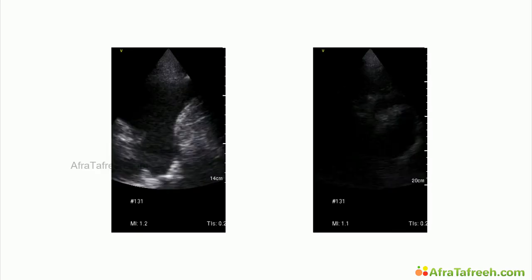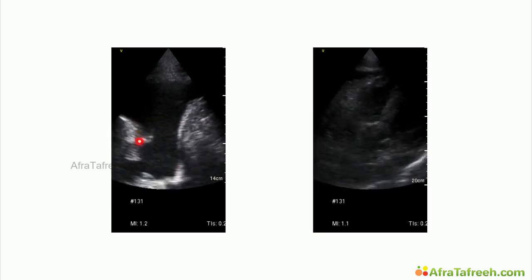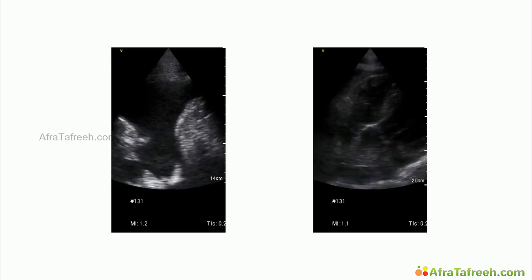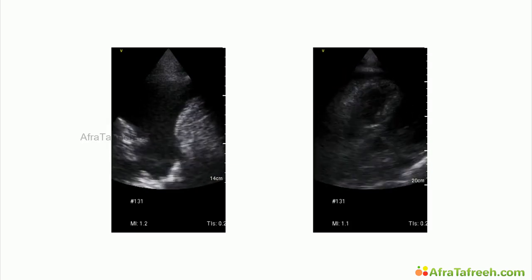There are two more organs you have to think about if you see such kidneys. First is the lung. We already saw pleural effusion present in this patient. The second organ is the heart. This patient even had pericardial effusion, seen over here.